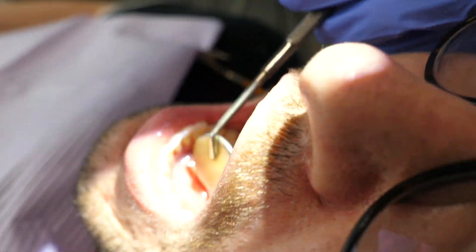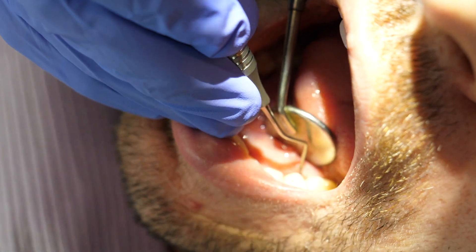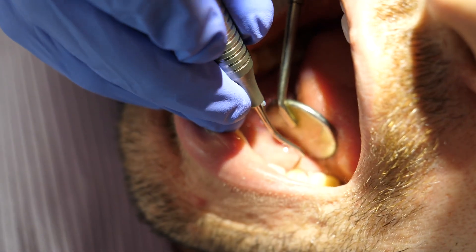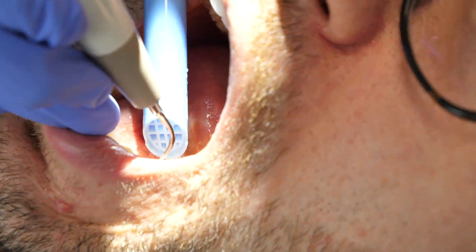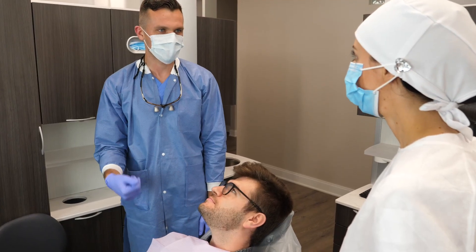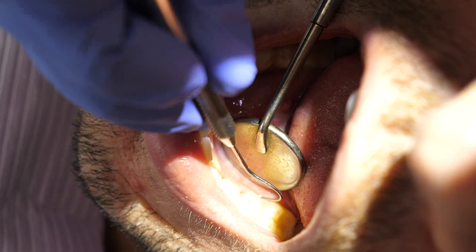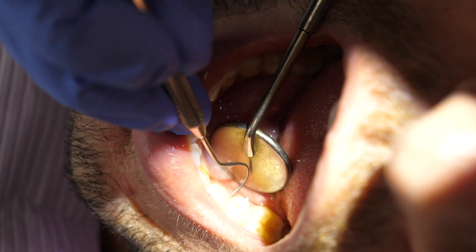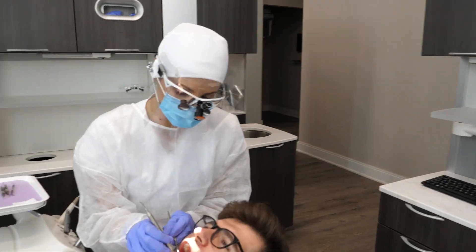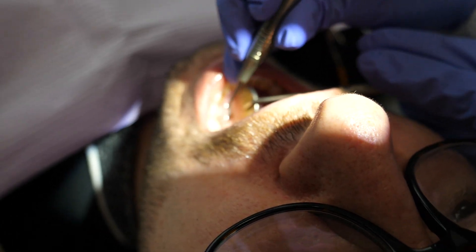It's always helpful if your patient is numb — obviously for an SRP we want them numb. But if it's not an SRP and it's just a random one-tooth area with a piece of tartar, you can always ask your boss if they're okay with you using some topical gel in that area. I've found that even dipping your scaler into topical gel on your tray can take the edge off for the patient. You just want to make sure they're comfortable through all of this as well.